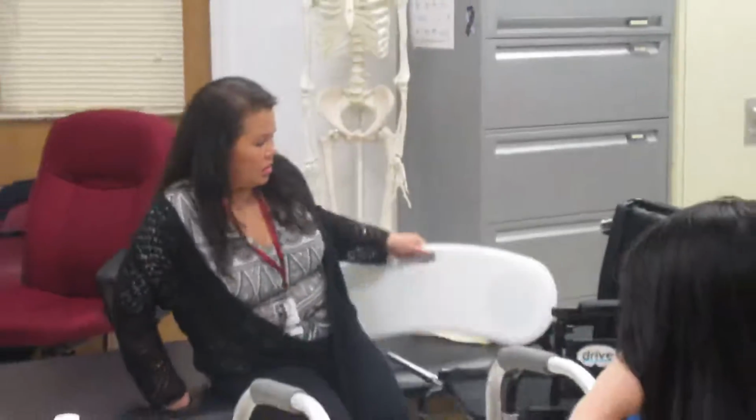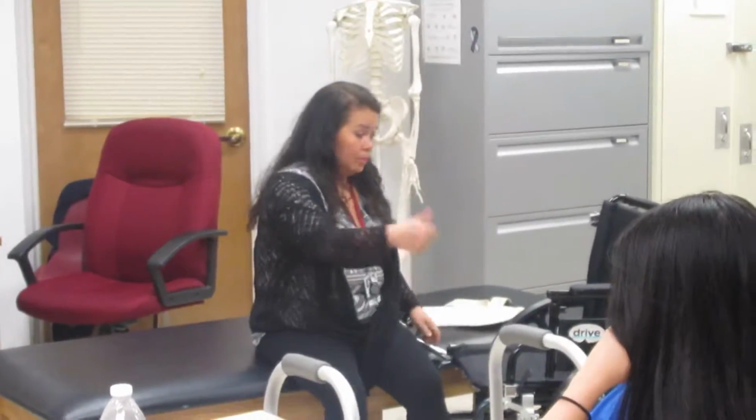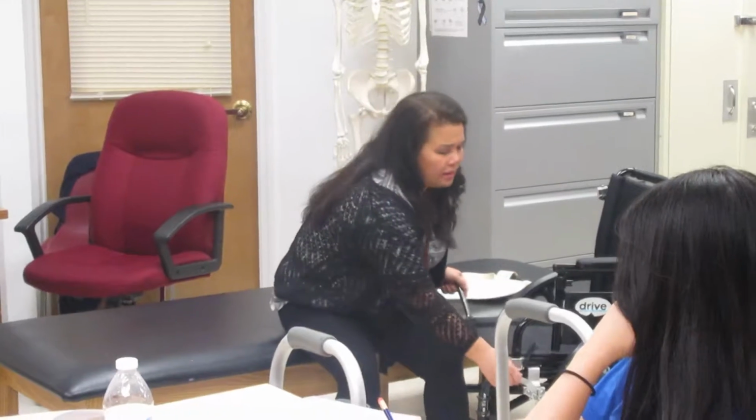Yes? How much weight can you put on? A lot. I'm like 300 pounds, so. Would you use gravity, like would the bed be lowered? Yes, I would. So if I was getting them out of bed, so let's say this is now my weak side, I'm going to move the chair to this side, right, to get them out of bed.